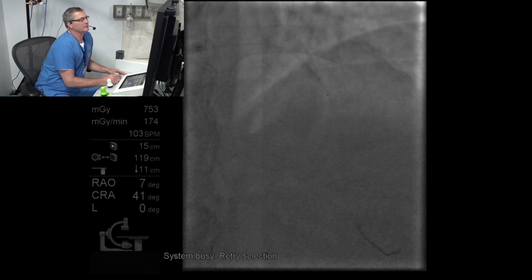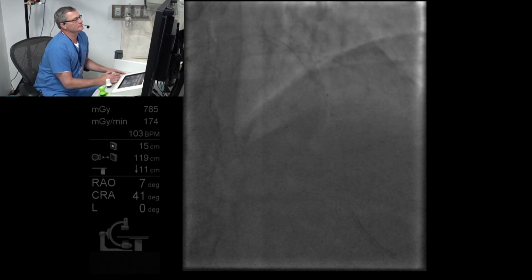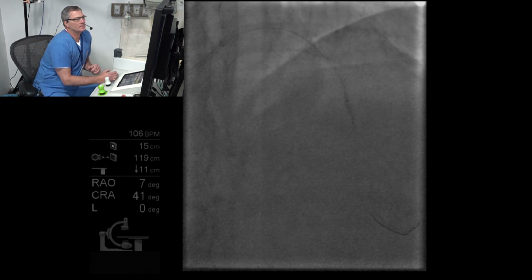Down. Let's try to center up on that lesion. Winged balloon. I've got to push my guide forward, pull my balloon back a bit. Good. So balloon up again. And after this balloon comes down, I think we'll take a test. There's a lesion right there we keep watermelon seating across. I'm going to try to get that centered properly. Down. Let's have a little test here, please.